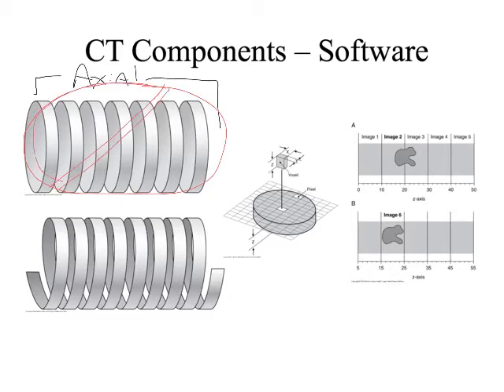We all know this is like the international sign of Ghostbusters or whatever. Because as radiation therapists, we are never, ever going to use axial scan modes for CT scanning. It's completely useless to us. We'll talk about why that is in more depth in the CT class.